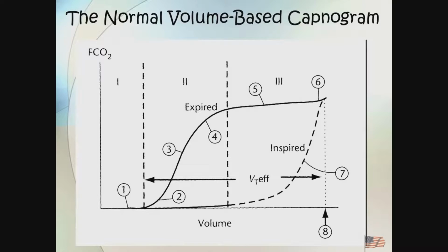So you not only have your infrared CO2 sensor, you also have a flow sensor that's monitoring expiratory flow. So I can correlate at what volume I start seeing dead space happen, and so forth. In fact, there's something called effective tidal volume. That's basically saying how much of your tidal volume you're actually utilizing that's benefiting the patient.